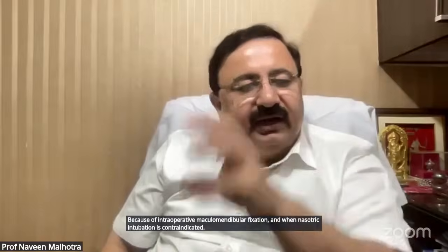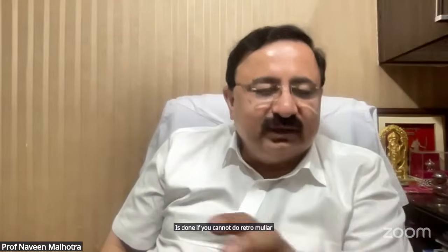When you cannot do an orotracheal intubation because of intraoperative maxillomandibular fixation, and nasotracheal intubation is contraindicated, then to avoid tracheostomy, retromolar intubation can be done. If you cannot do retromolar intubation, then submento-tracheal intubation is done. Okay, sir, thank you.